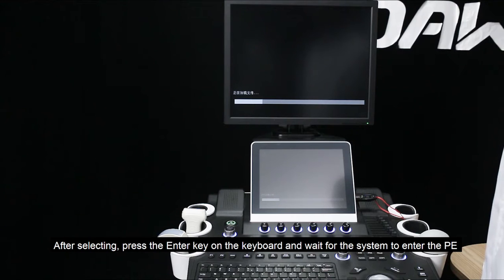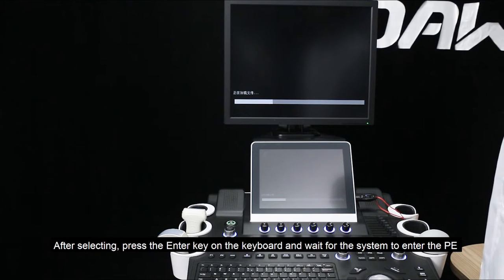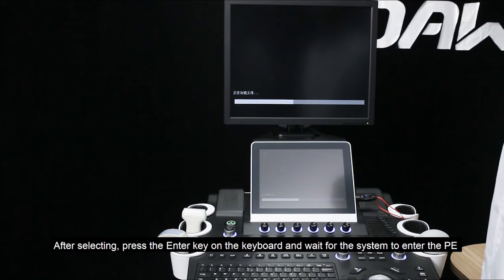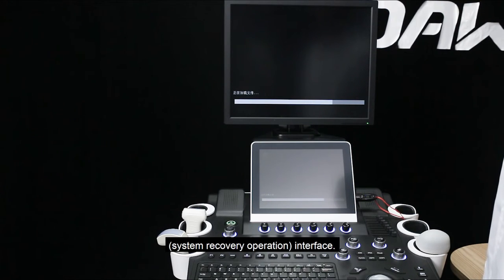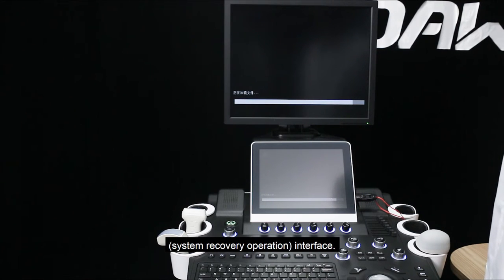After selecting, press the enter key on the keyboard and wait for the system to enter the PE system recovery operation interface.